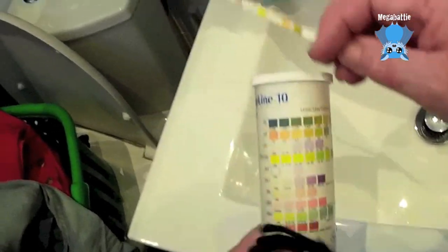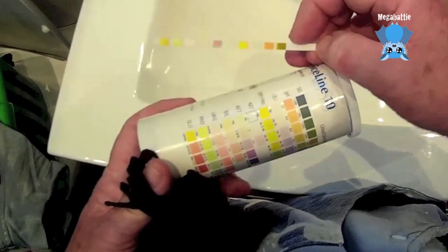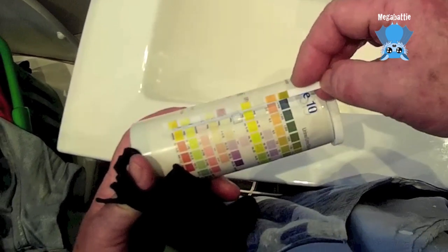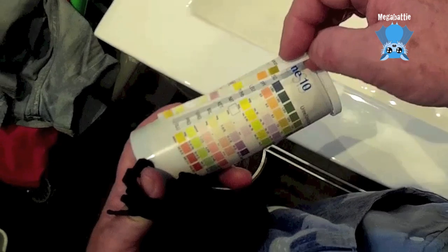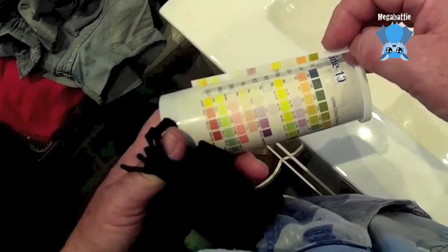Why are you showing leukocytes? Because I've actually touched it on the wrong thing, didn't I? You're not. Specific gravity, pH is okay, leukocytes are okay, even though I played with it.